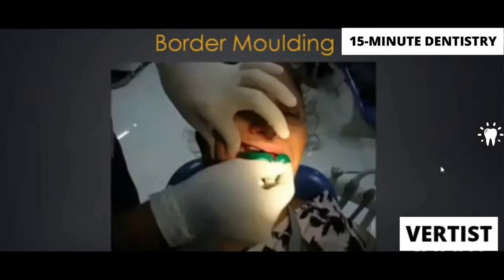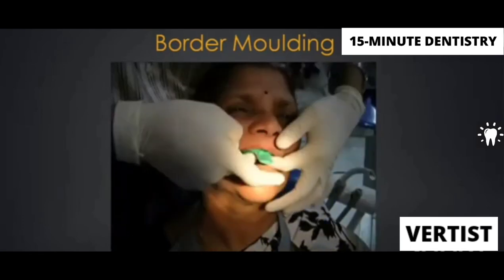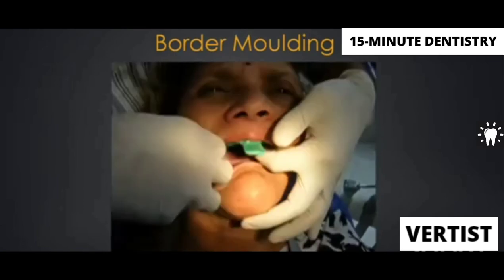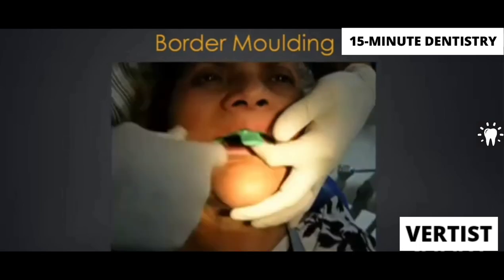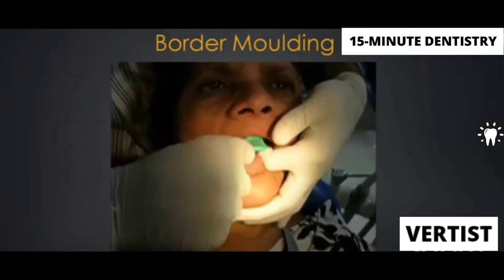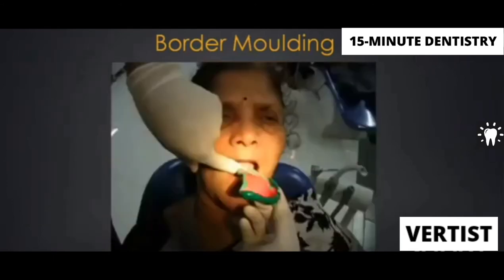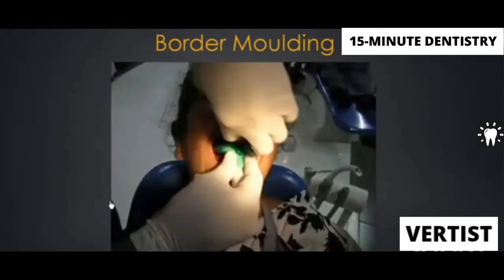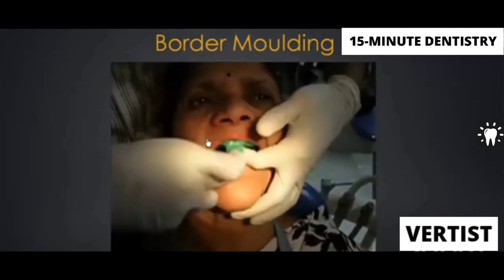Then for the buccal frenum, the videos are not playing correctly, there's some issue with the internet. So as I said, up, out, down, and then anteriorly and posteriorly, up, out, down, anteriorly and posteriorly, don't forget that. And then the part posterior to the buccal frenum or the buccal vestibule is called the coronomaxillary space. Right at the back, which is buccal to the maxillary tuberosity. It is affected by the coronoid process of the mandible.